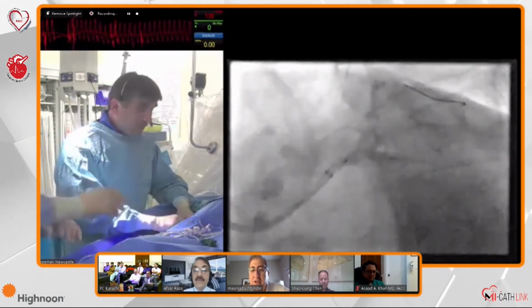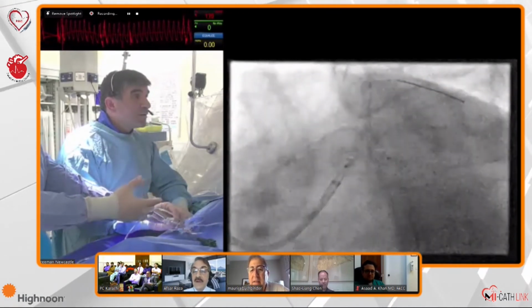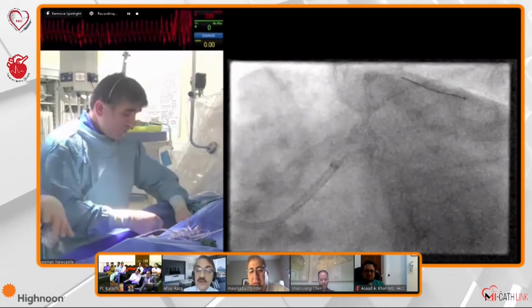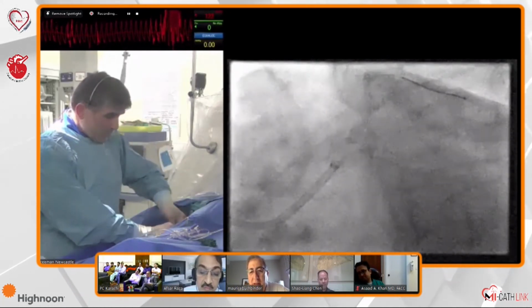Congratulations for an excellent case. Give me just a couple of minutes. I'll show you the IVUS because I think that's important. Yes, if we have time. We have 2 to 3 minutes.